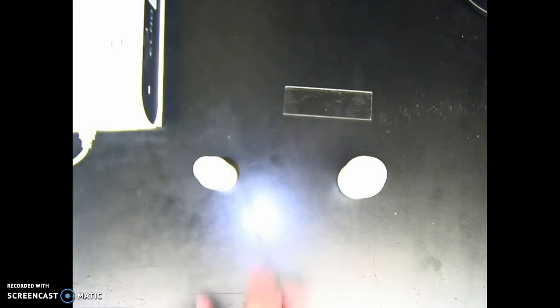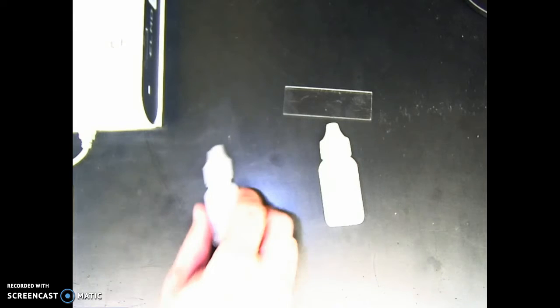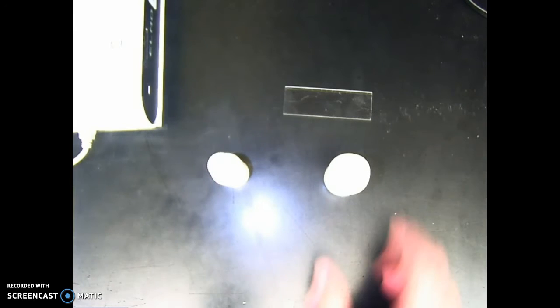Large bottles are going to indicate which letter the person has for their blood, so you can indicate based on this if they're going to have A, B, AB, or O. The little bottles correspond to the ability to identify if they have positive or negative blood. That's why each person has a big bottle number and a little bottle number, because you're going to have to grab that for each person.